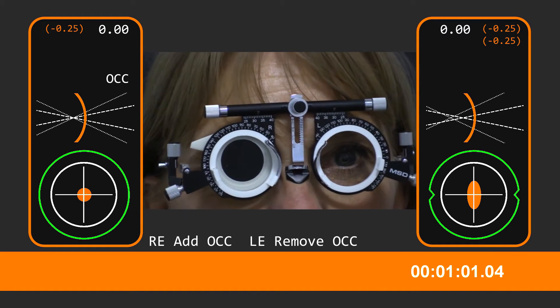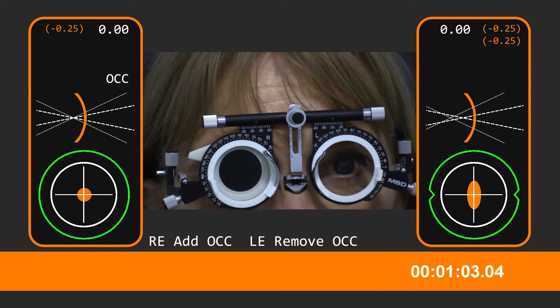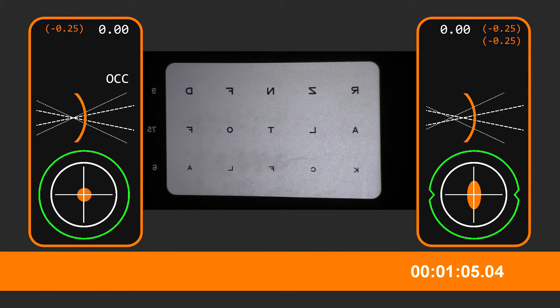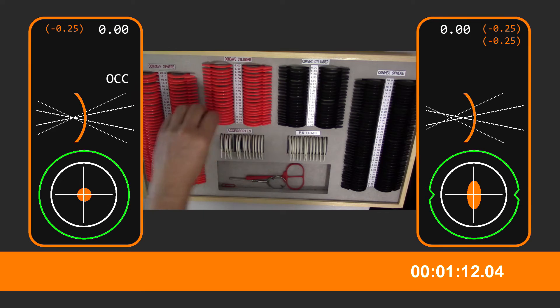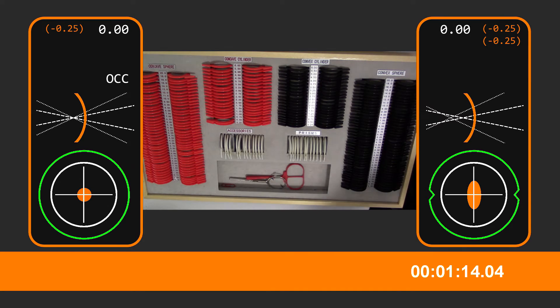What about this one? Oh, my God. R, Z, N, F, D, A, L, T, O, F. I can't read the bottom line on that eye. Oh, that's going bad, isn't it?